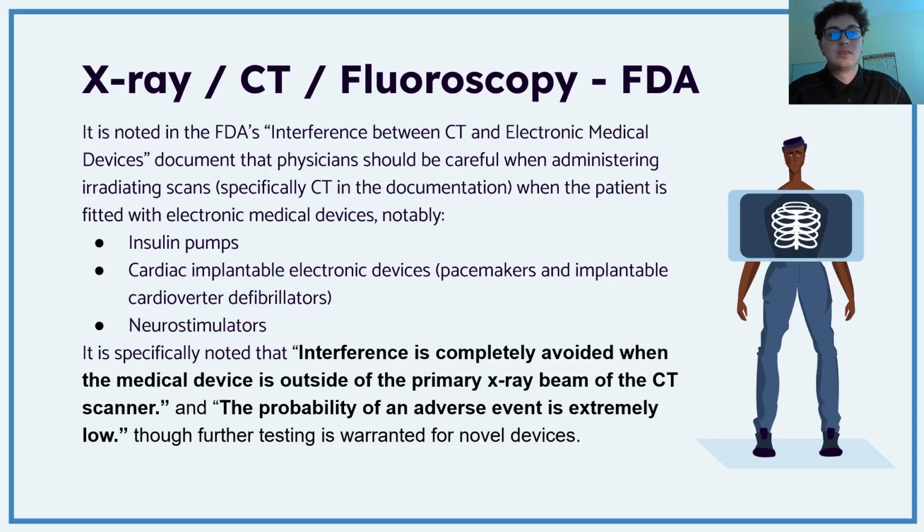One thing to note is further testing for a novel device is warranted, whether or not this will be a problem, and if so, the physician should be notified, and they can plan accordingly to try and avoid the primary X-ray beam on the device.